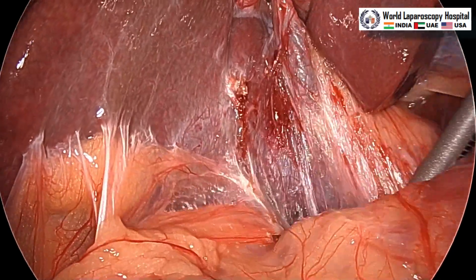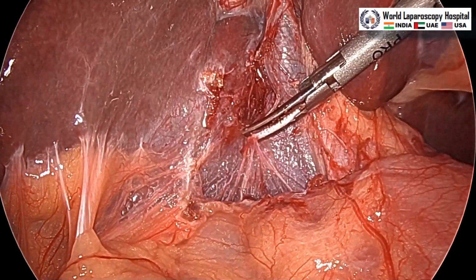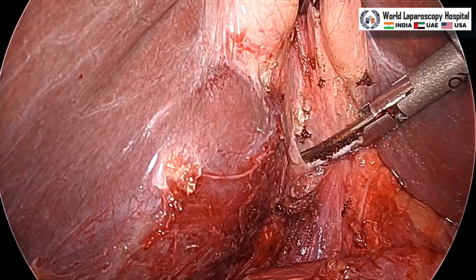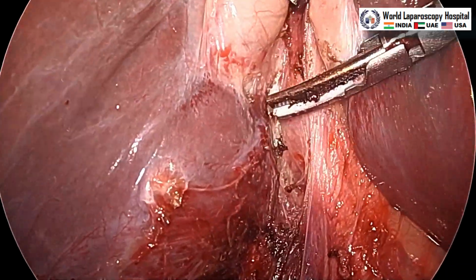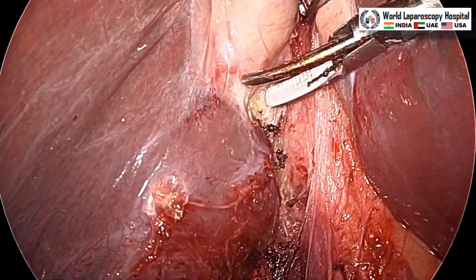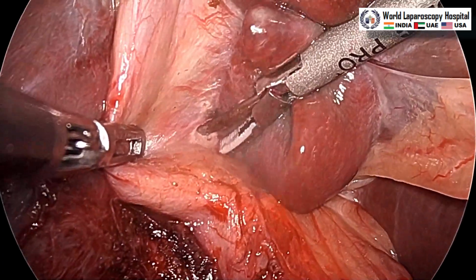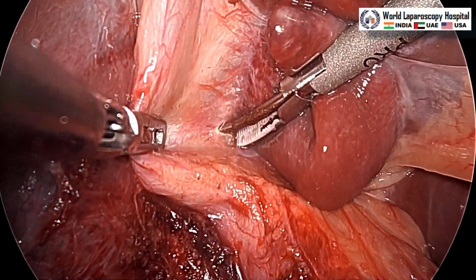And these adhesions are separated. At that level we have the Rouviere's sulcus, so that will be visualized, and then the Hartmann pouch is given anteromedial traction and this is the posterior peritoneum which is separated up to one third of the gallbladder. Now, this is anterolateral traction and the anterior peritoneum is separated, only peritoneum, as near as possible to the liver, so that it will help us to make the posterior window.